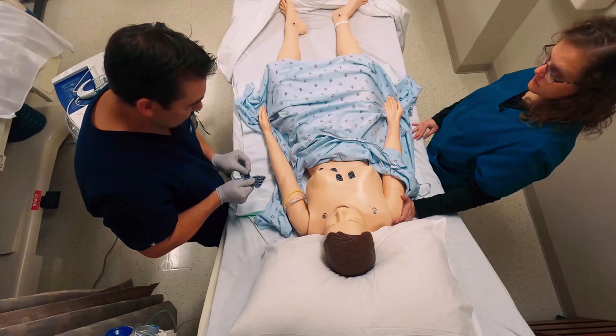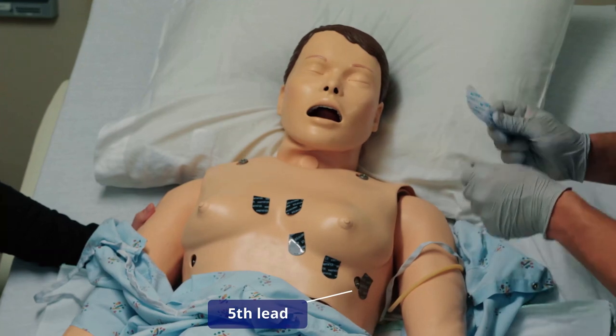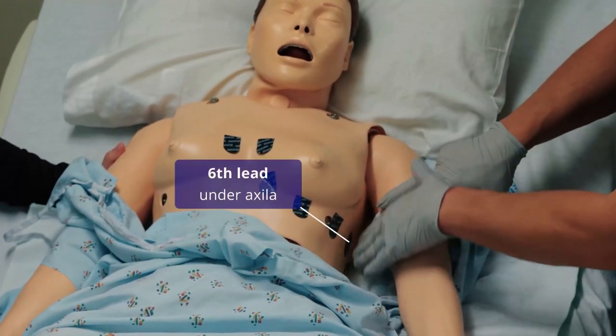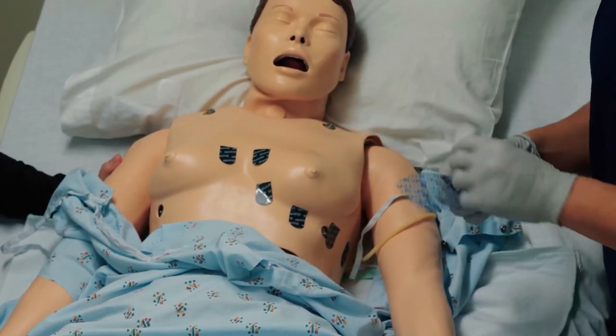Lead five should be right here. Now the rule of thumb for lead number six is that it should be right here on the axilla — right under the armpit. That is the goal. Remember, we're trying to wrap the heart to get these views of the myocardium.